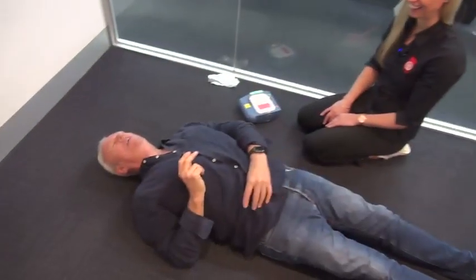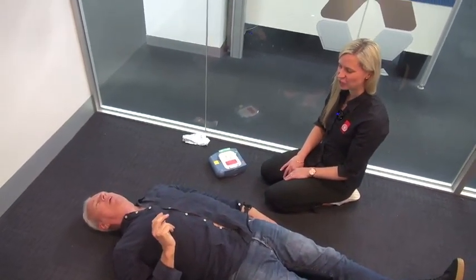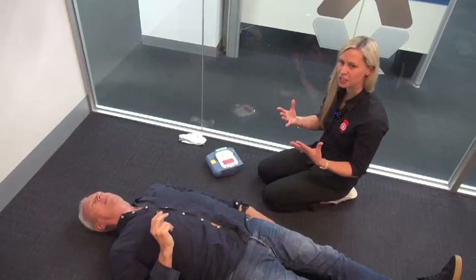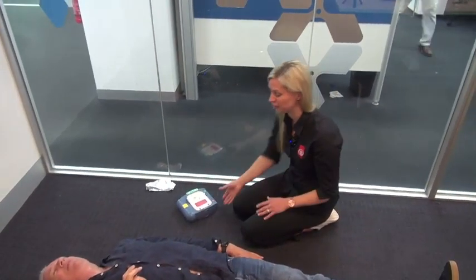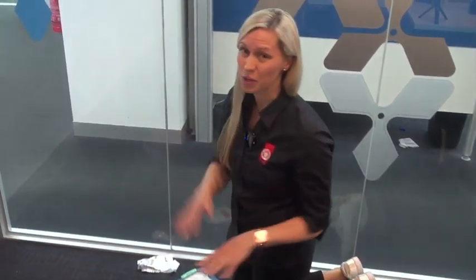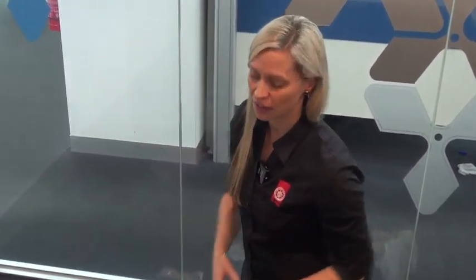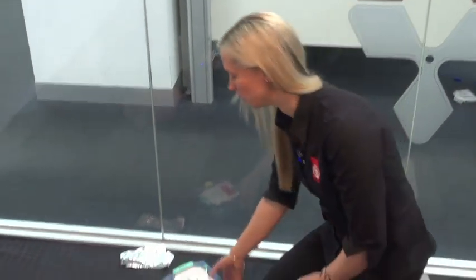Beautiful. Which is not hard, so I'm on the ground, I'm unconscious — what are you going to do to me? So just to clarify, he's unconscious, he's not breathing. We've run through our action plan, we've called for help, I've got a defib with me and we're actually doing CPR — technically he's unconscious, not breathing, and someone's doing CPR.